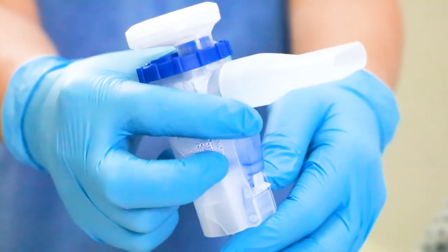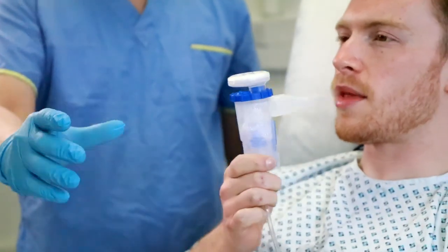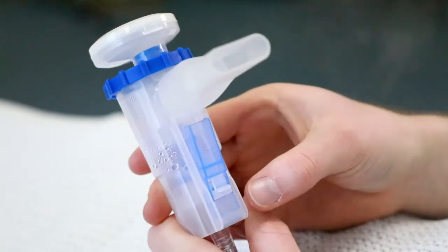For continuous operation, depress the trigger and slide the lock down until it clicks. To release the trigger, slide the lock back up.